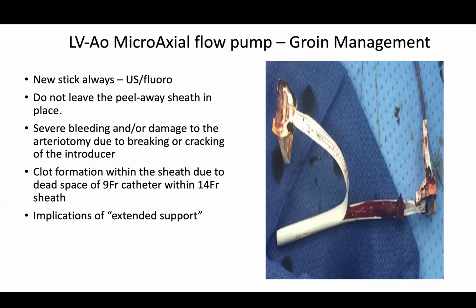Why do you think that you always need a new stick? Like if it's coming from L&M and I did the stick and it was sterile and everything looks perfect when it arrives there, what's the issue? I think the rewiring and taking out the balloon pump can get you in trouble. Like let's say the balloon doesn't come out and you tear the arteriotomy and then you put another sheath in. I don't know what's going on there. So yeah, this is something that we could review together as a group.